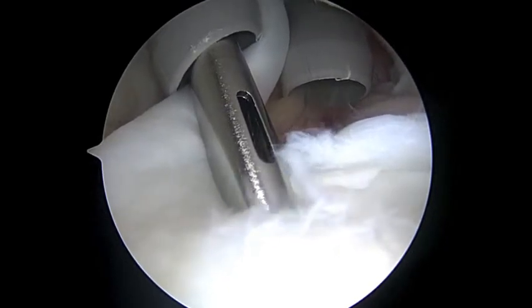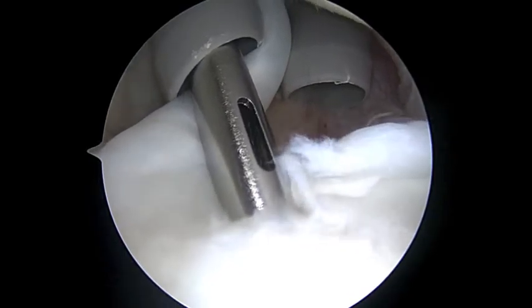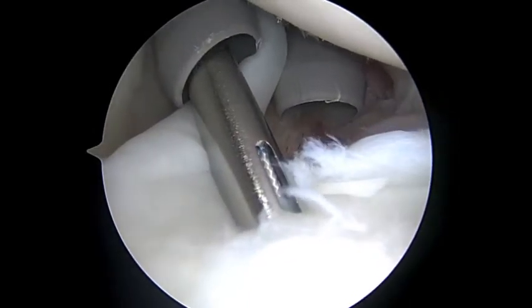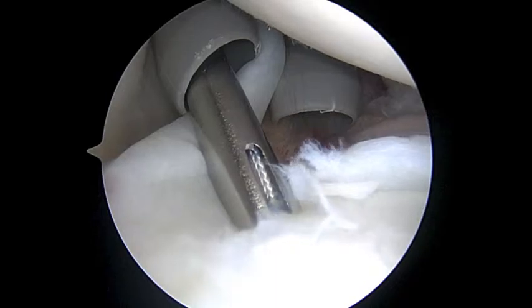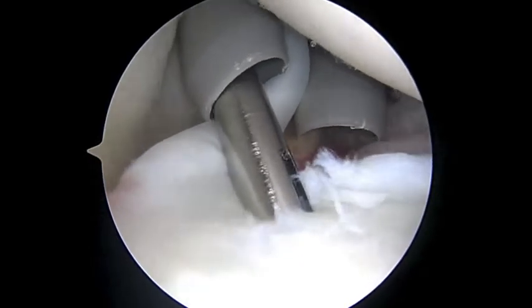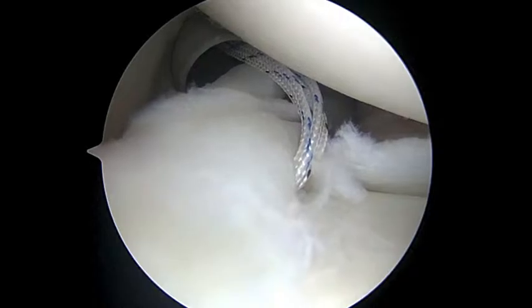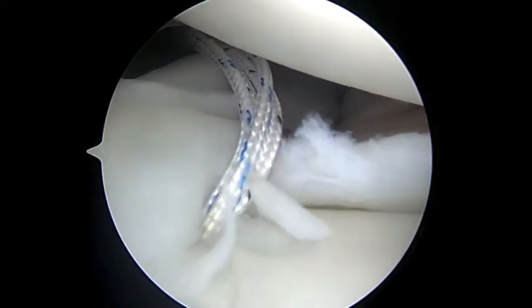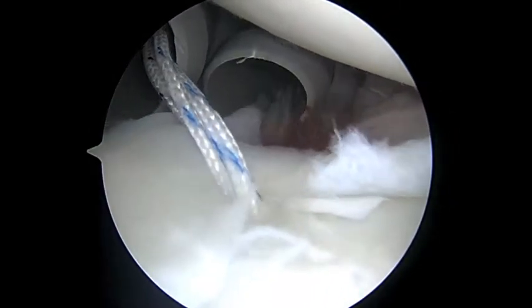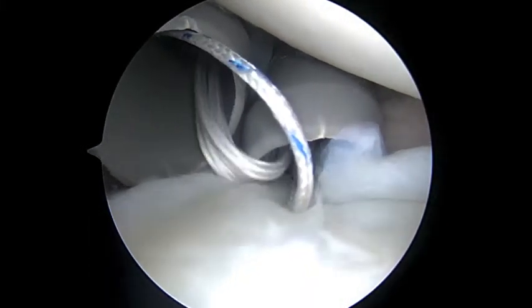We're going to put the camera in the back where that yellow cannula is. We're just getting ready to drill the hole for the next anchor. This is the anchor that we use to repair the biceps tendon for the SLAP lesion. We'll mallet that down into position. What's different about this anchor is it's got two sutures — it's a little bit larger than the anchors we've been using so far.